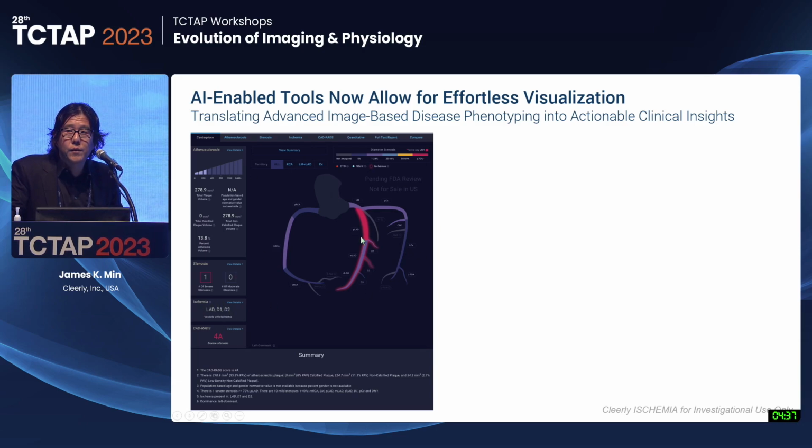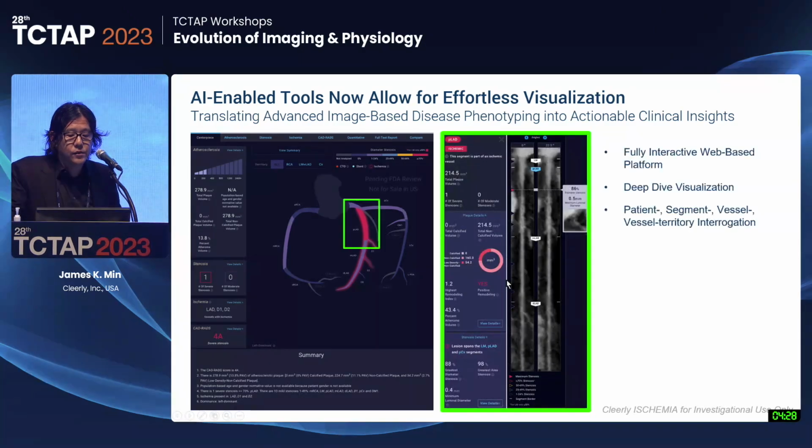and then also to make this interactive, so that you don't have to go down to radiology and find a CD, but rather you can just press on any place within the coronary tree and start to really understand things in greater detail. So if you press on this LAD lesion in the proximal LAD, now you can dive deep and relate everything that's going on related to the coronary atherosclerosis, the plaque morphologies, vascular remodeling, stenosis severity, minimum luminal diameters, and so on.